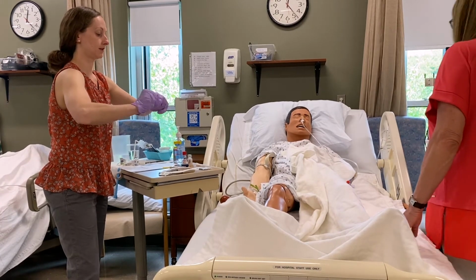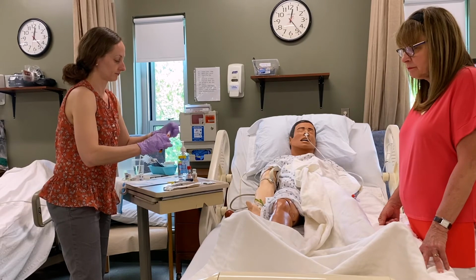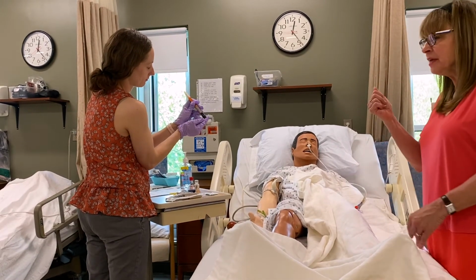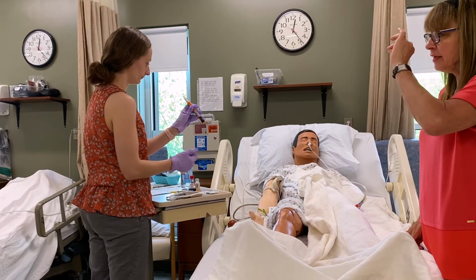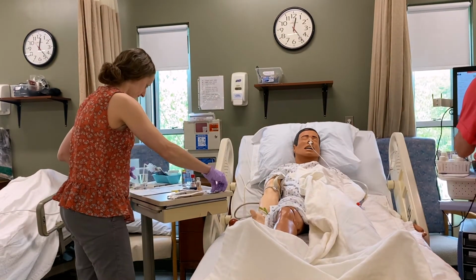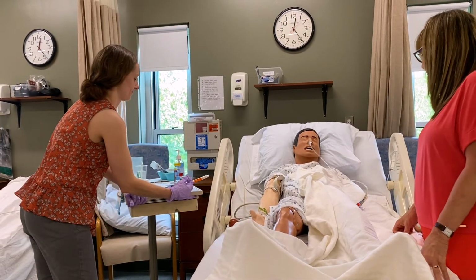I'm going to cleanse my pen. Good. I'm going to prime 2 units. She's priming the pen with 2 units to clear it and to engage the needle to give an accurate dose. And I'm going to set my 4. 4. Okay. Novolog. Okay. 4. Very good. All right.